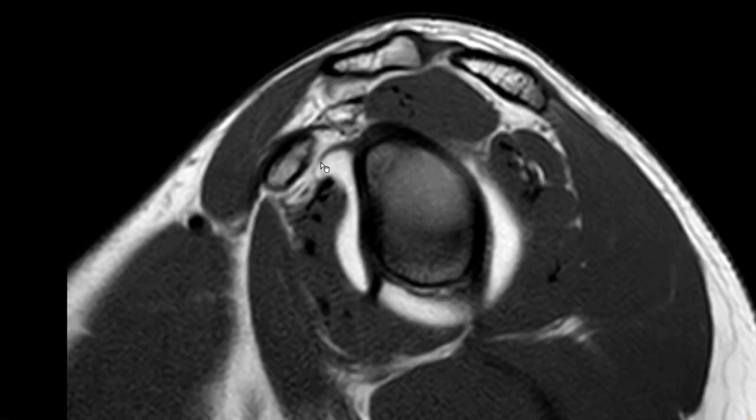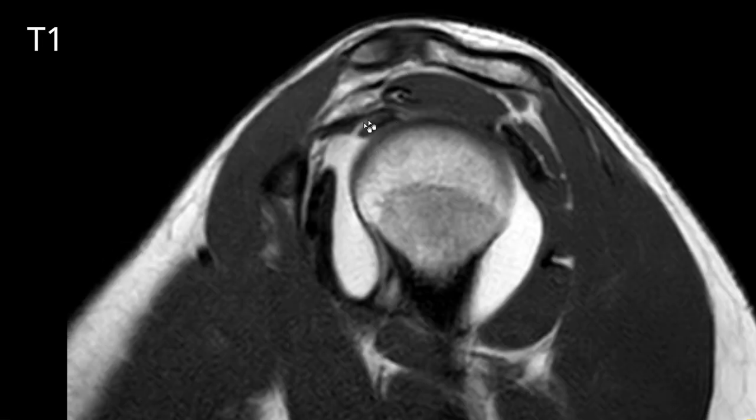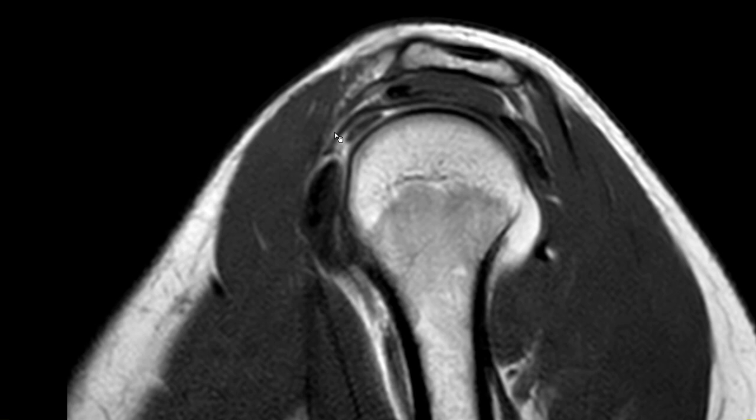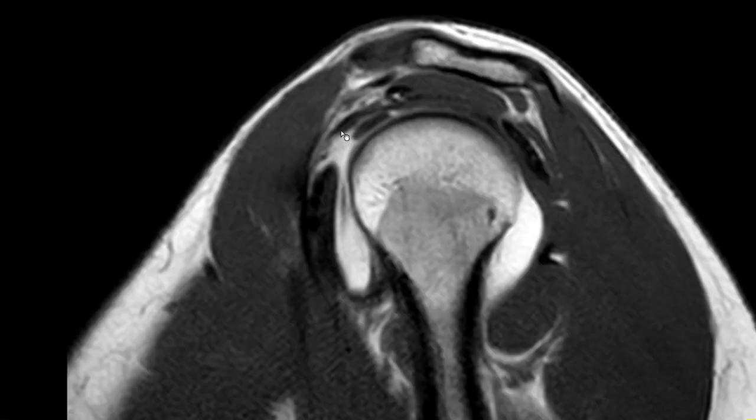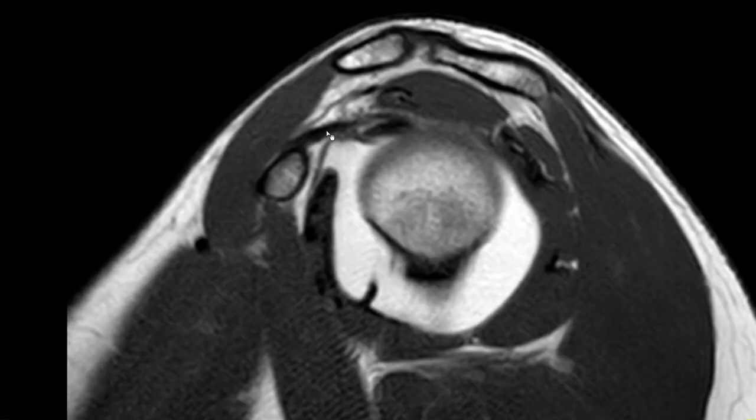In this space we have the coracohumeral ligament, the long head of the biceps tendon, and the superior glenohumeral ligament forming the biceps pulley system. You can see the ligament is not really thickened — it's how it's supposed to be. In the literature some use a cutoff value of three or four millimeters depending on how you measure. So this is normal.